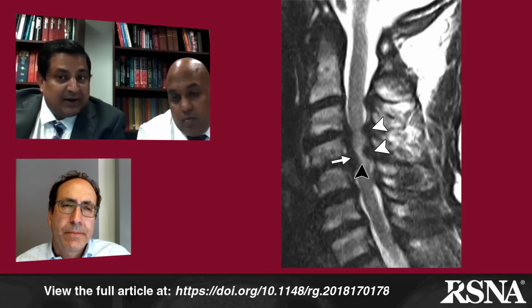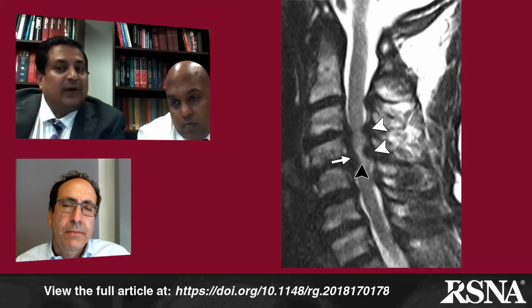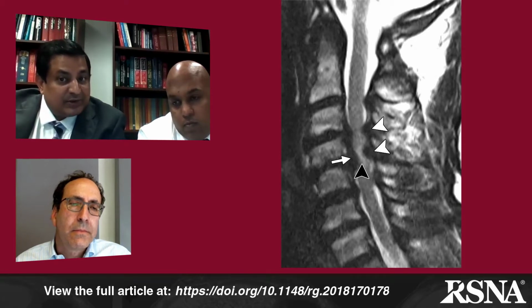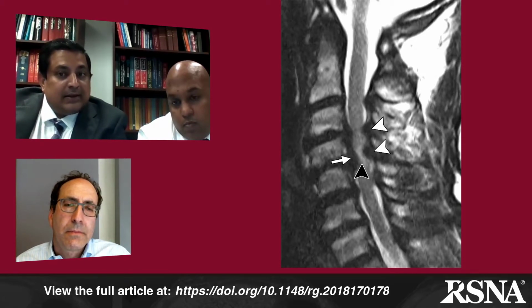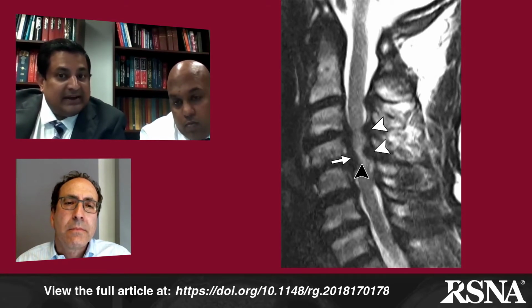It shows cervical spondylosis with cervical stenosis in a 73-year-old man presenting with burning sensation and weakness in the upper extremities 2 years after a fall. Sagittal T2-weighted MR image shows severe cervical spondylotic changes. Arrows point to disc osteophyte complex. Arrowheads point to ligamentum flavum buckling. White arrowheads point to buckled ligamentum flavum. Black arrowhead points to mild increased signal in the cord secondary to myelomalacia.